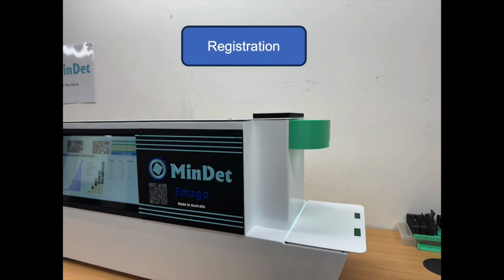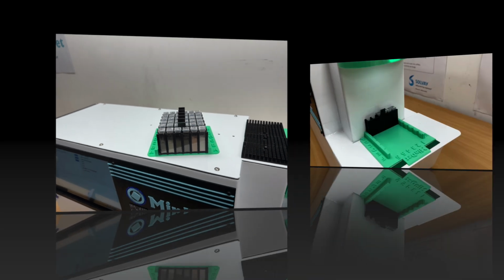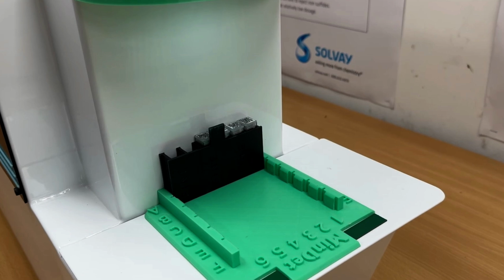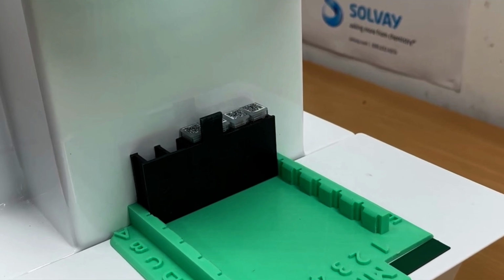The sample registration station can accommodate up to 6 sample holders, each with 6 cuvettes. The total of 36 cuvettes represents 18 full samples. This is the maximum number that can be registered at one time. However, in this example, we are only going to load the first 4 cuvette positions of one sample holder. This will be the 2 full samples shown before.